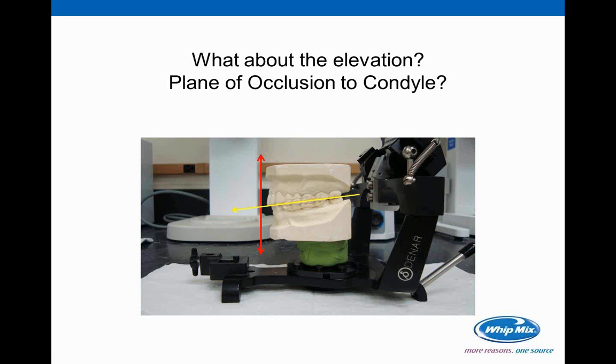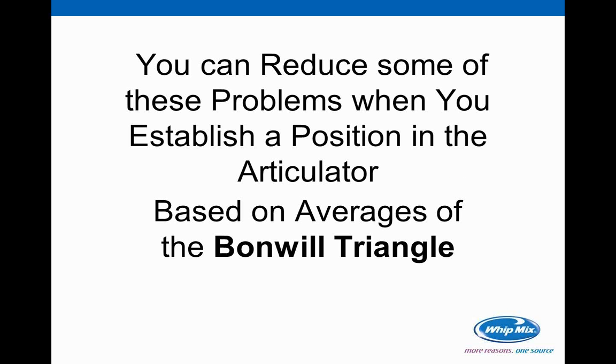But it's still way too arbitrary. We just have too many pieces of information that may or may not apply to what we're actually doing here. And so how do we come to a basis for doing things correctly and at least getting as much correct information as possible every time?